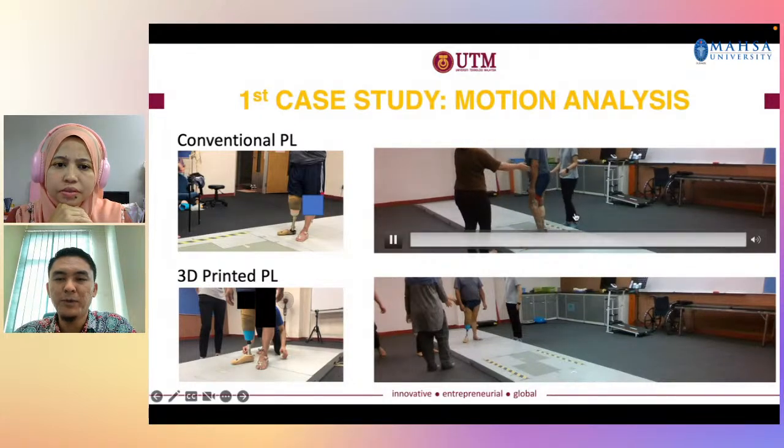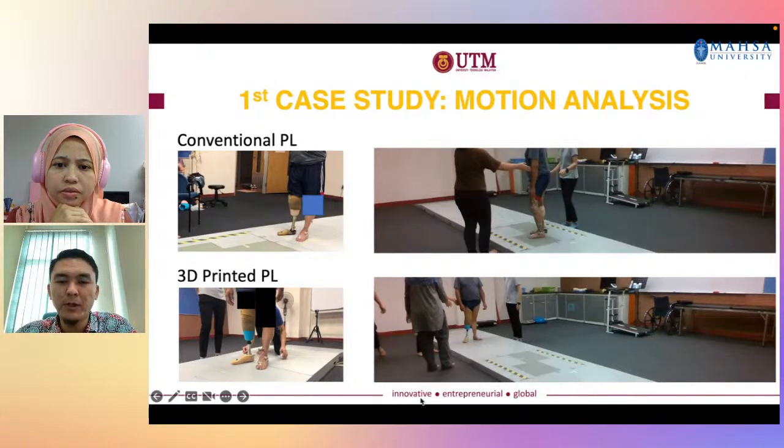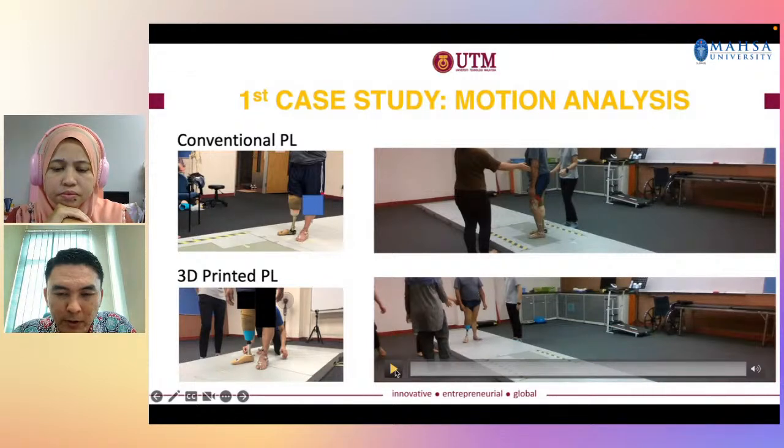So the patient steps on the force plate, so we can get how much force is coming from the body. The next one is the patient wearing the 3D printed prosthetic leg. So I will play the video.